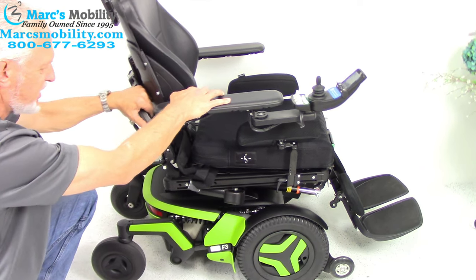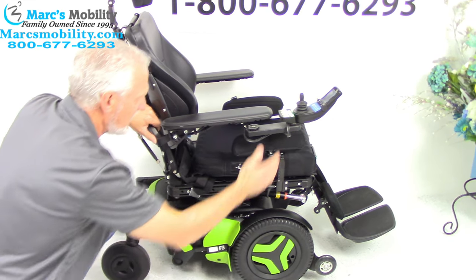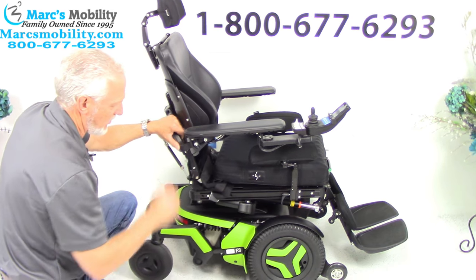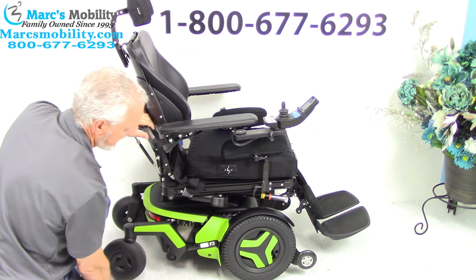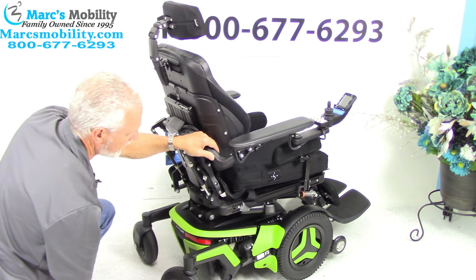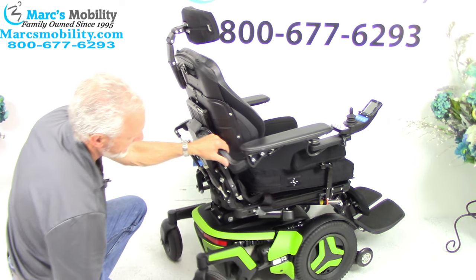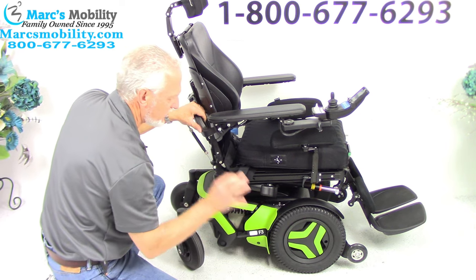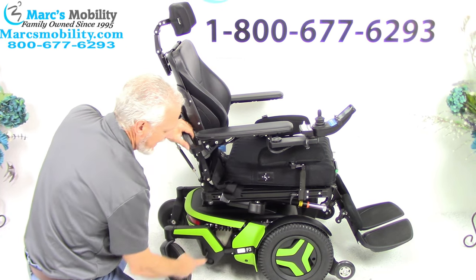If I was to push this chair right now I can't, because it weighs 350 pounds plus it's in gear. But if I turn the power off — and you want the power off so there's no resistance in the motor — push the lever down. See that? That unlocks the wheel. You have to do both motors and then you can wheel the chair around. But do not forget: once you wheel the chair around, put it back in gear.